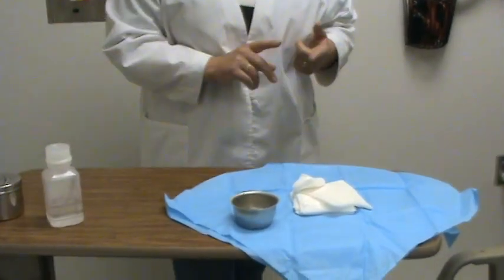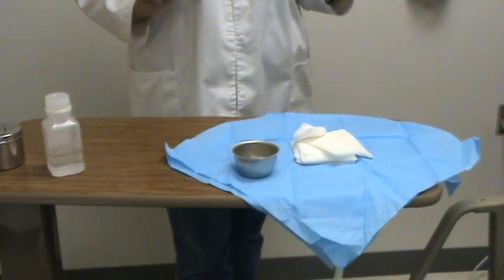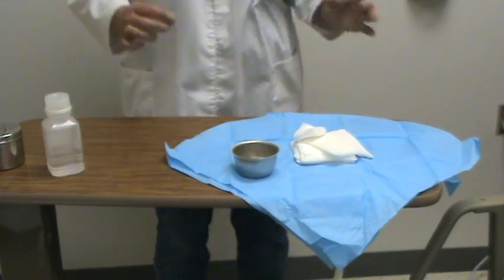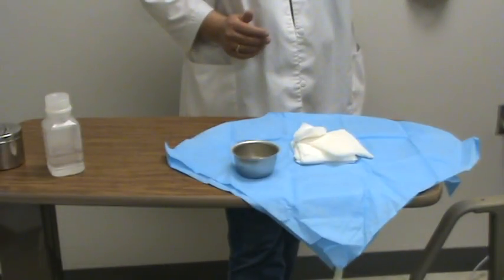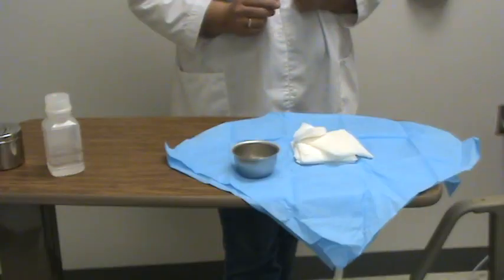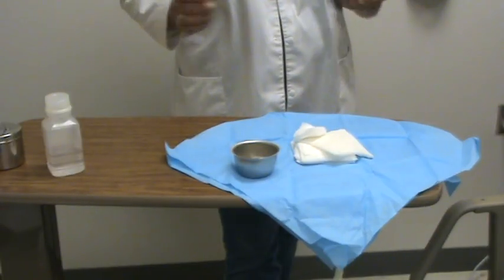I've got an extra 4x4 on there, 2x2s on there, and my solution into the bowl — I think I'm ready for the physician. If needed, you could open a sterile drape and put it over your sterile field to keep it contained and sterile while waiting. Make sure you watch your Mosby DVDs because they have a lot of very good information. And that completes this skill.